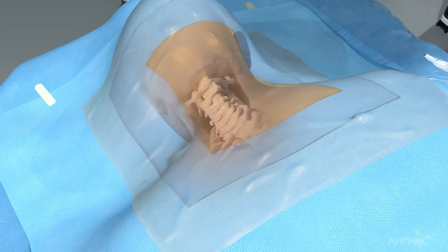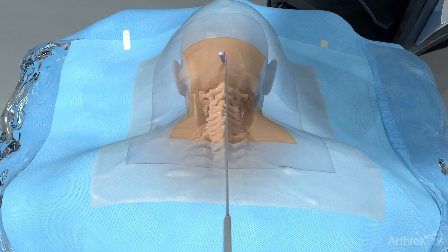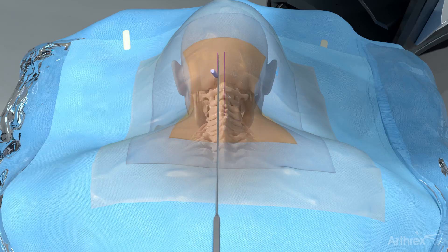The patient is placed in the prone position. The midline is marked by palpation, followed by a second mark one centimeter lateral to the midline.